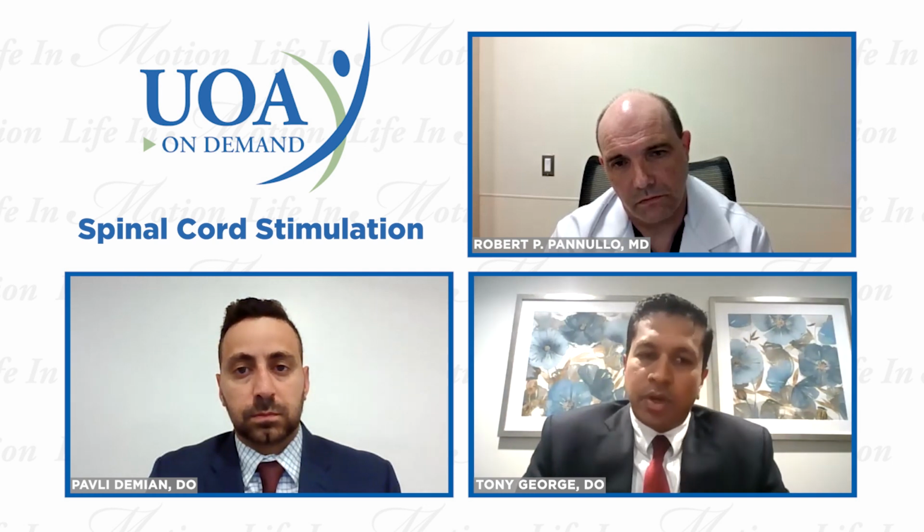Can I try to at least do one more epidural or try to do another transforaminal injection just to see if I can do one of two things. One, see if I can give them relief, maybe where some others have tried and may have failed. Or number two, if that's not achievable, at least to confirm that yeah, it is coming from this persisting nerve pain that is going into the limb, and get that confirmed. Once I have achieved that, if I've diagnosed that yes, there is a specific nerve that's irritated, then I go ahead and schedule my patient for a spinal cord stim trial.